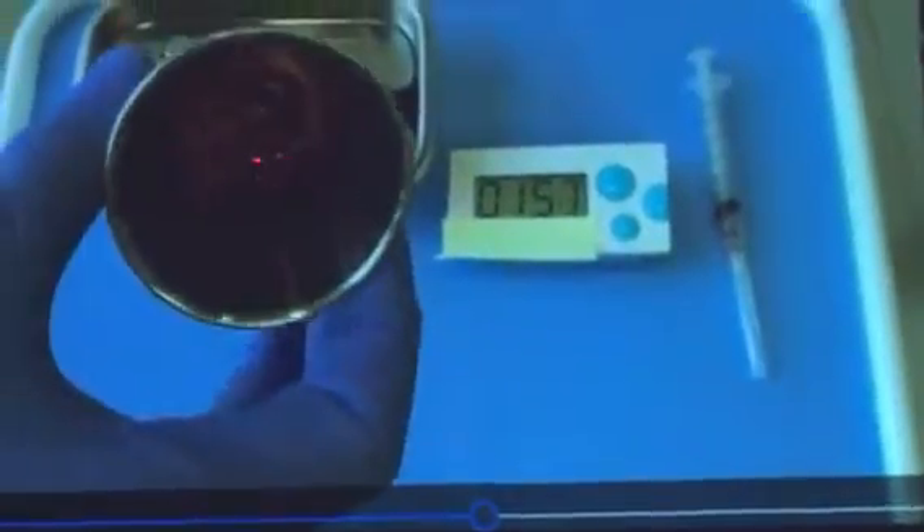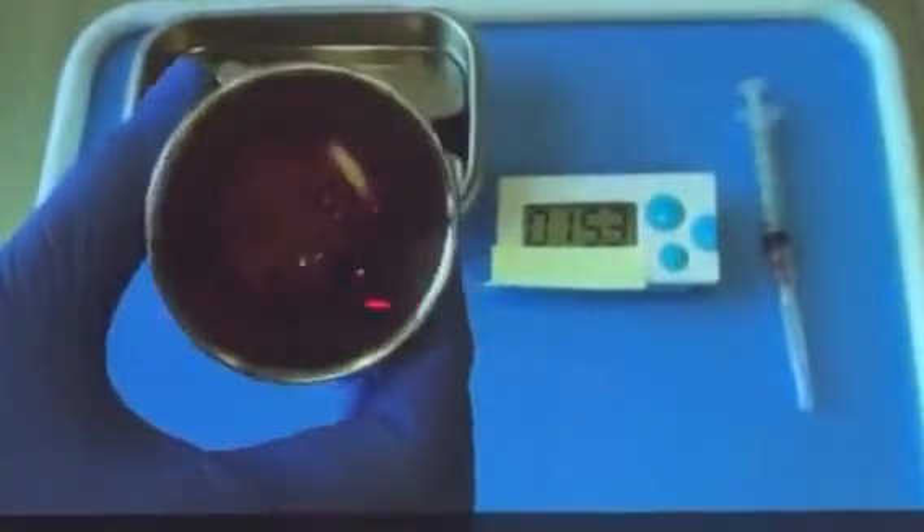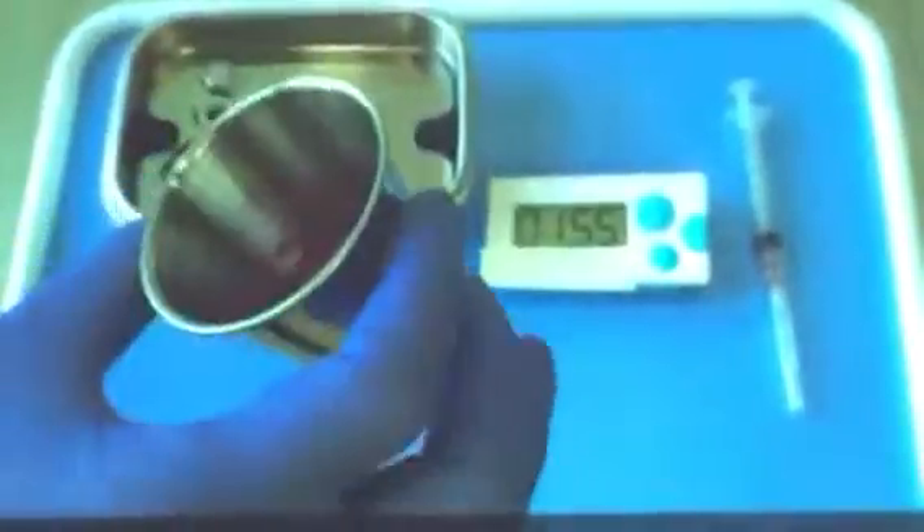That's less than two minutes and it's pretty much all sticky. You're going to see a residual little bit of liquid — that's fine, just dump it.